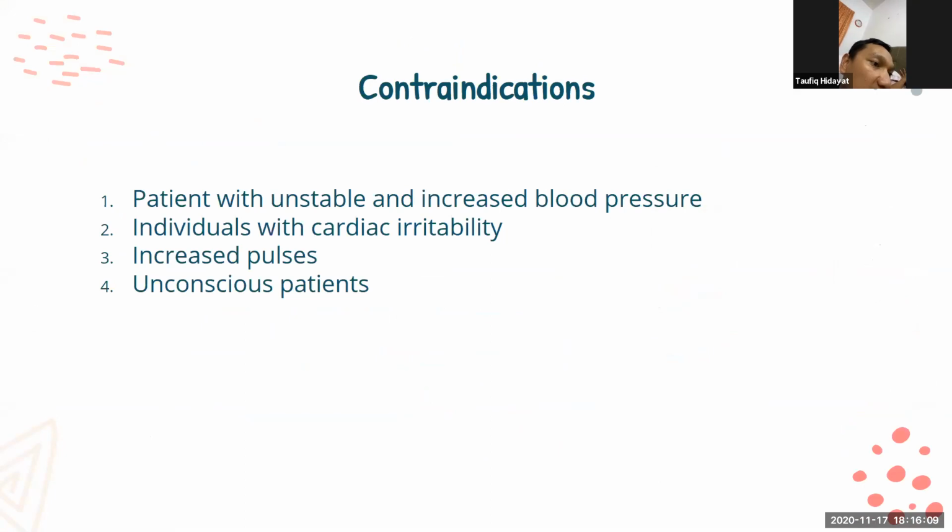When you nebulize a child, aerosol comes out. If you nebulize a COVID patient, the virus will go with the aerosol, flying in the air. So it is not allowed now. Even in the ward we use MDI now. This is the important thing you must know for current practice.